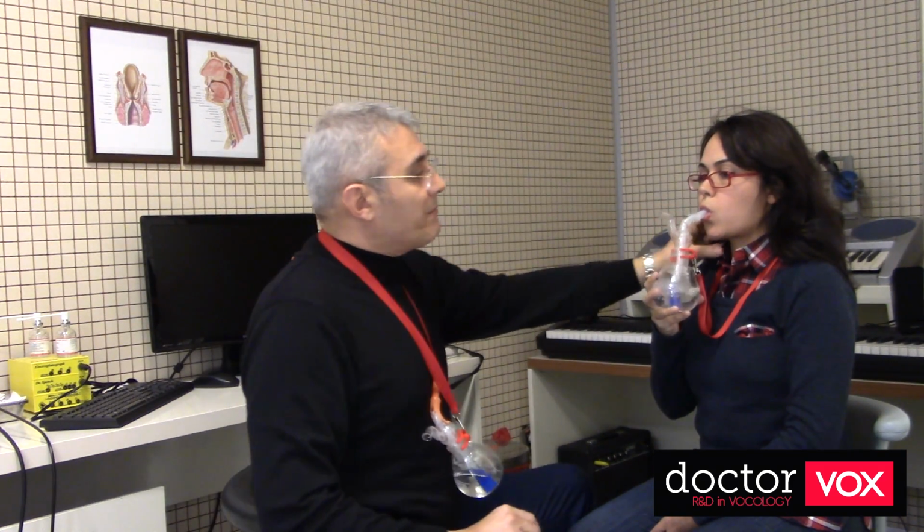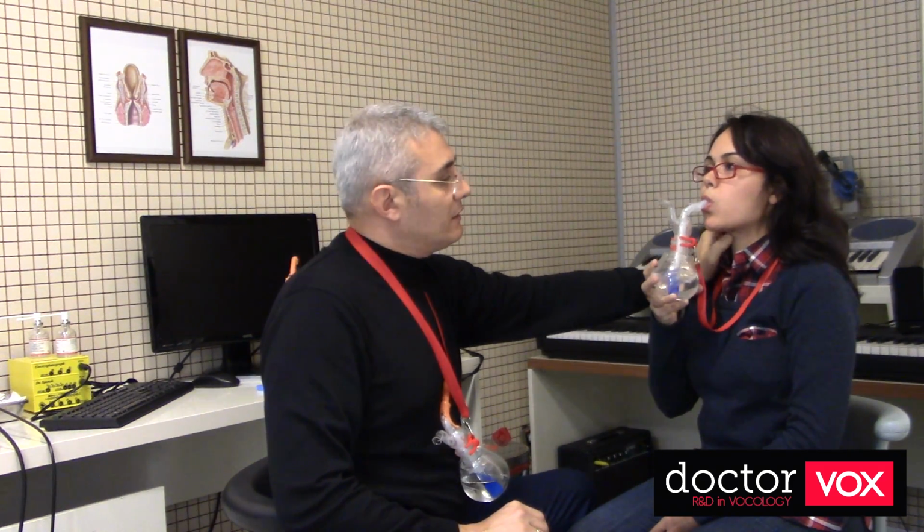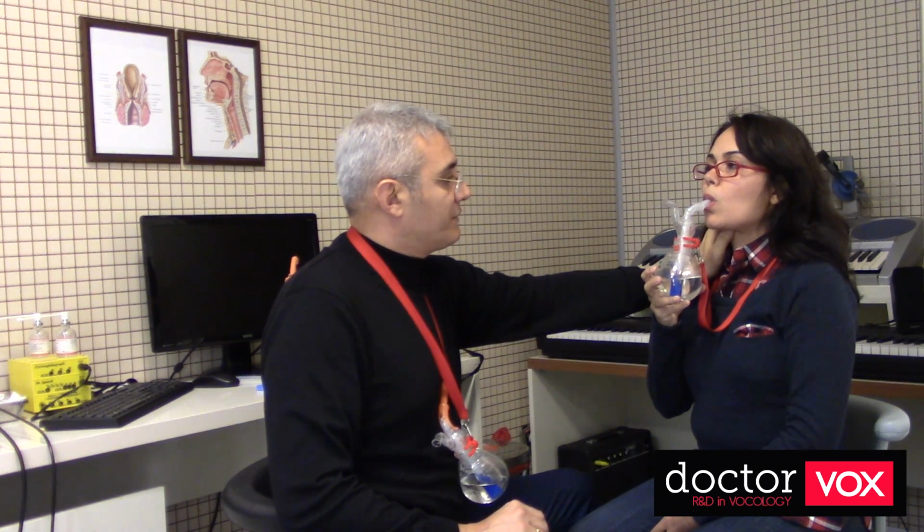Just imagine that there is a small H in the who, not in the beginning, not like who, but like who. Yeah, could you please? During this phase, you can palpate the submental suprahyoid part of the neck and make the patient not to contract all of these muscles there, like that.